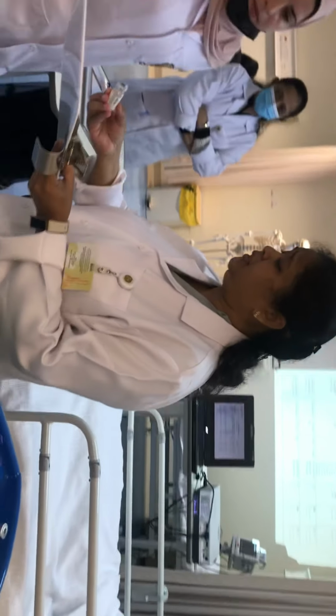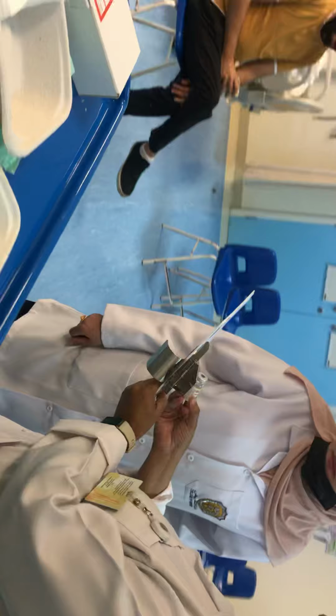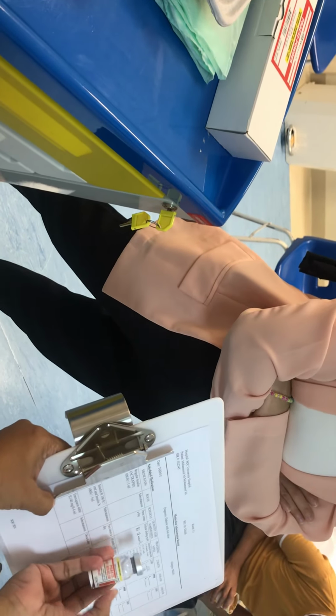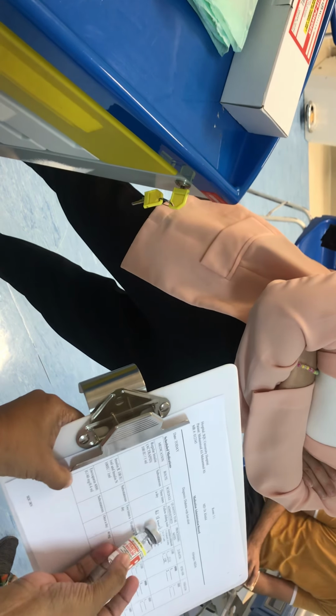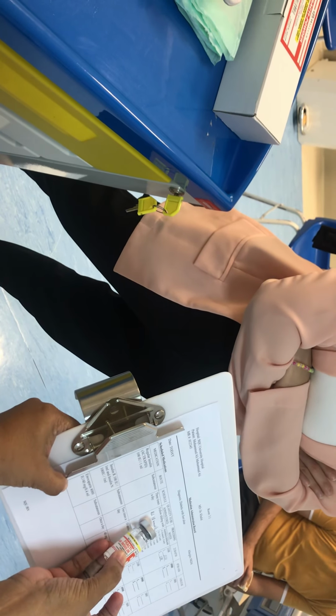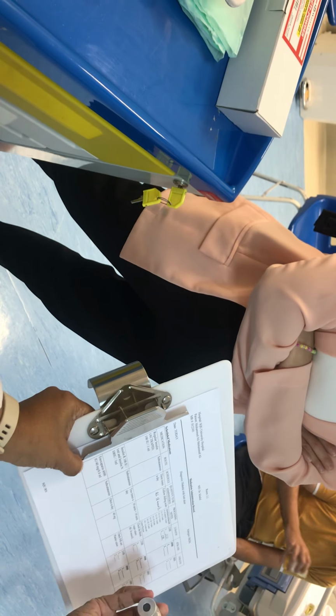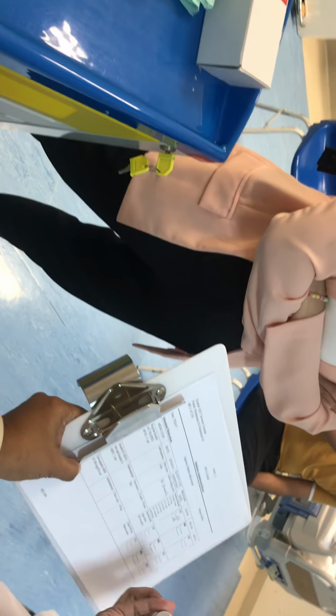Okay, they need to read carefully. Regular insulin, and it is 100 units per ml, is available. Here also it's written. Then, because the blood sugar is 18, I'm going to take 10 units. The expiry date also they have to see. It's not expired.